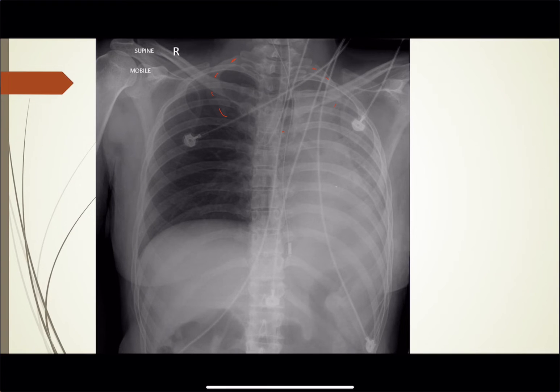You can see here this is the first rib coming down and around, and here's the first rib on this side. This is the second rib — you can see the second rib is attached at this point, that's your T2. So you can count down: T3, T4, T5, T6 — so your carina is going to be right in this area, T5-T6 to T6-7. And this is your ET tube coming right down here.